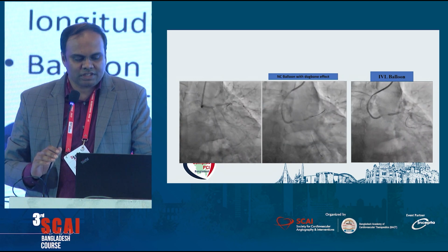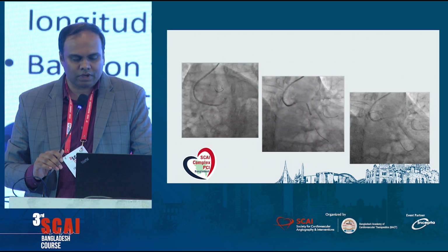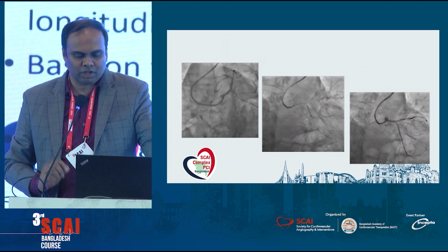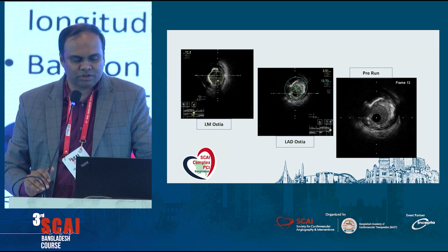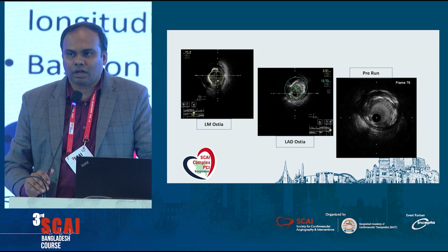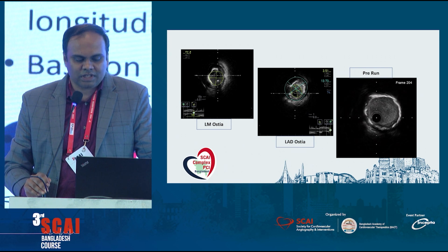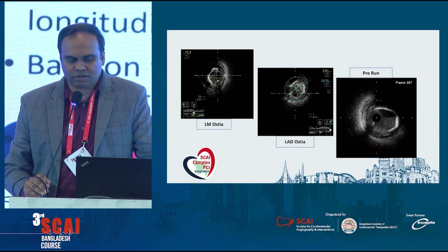My take-home message: the burden of large calcified plaque adds an extra level of clinical and technical complexity to PCI, and it has become more evident that a combination of intravascular imaging and novel therapeutic techniques represents the treatment of high calcium levels. Intravascular imaging can provide the degree of calcification, its location, distribution, concentricity, eccentricity, thickness, and longitudinal extension.